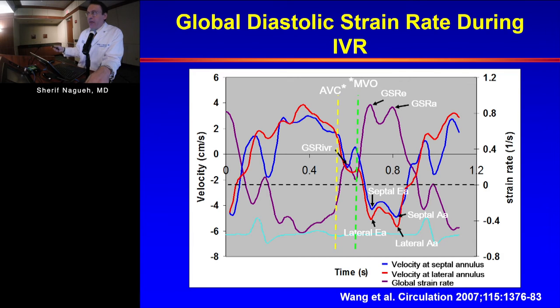So far, we covered tissue Doppler velocities. We talked about their limitations. We covered mitral inflow, pulmonary veins. And these are the routine measurements that we get. We look at PA pressures, TR and PR signals, if you have them. You also look at the presence of LV systolic dysfunction, present or absent, LV hypertrophy, presence or absence. We try to integrate all this data in arriving at conclusions.